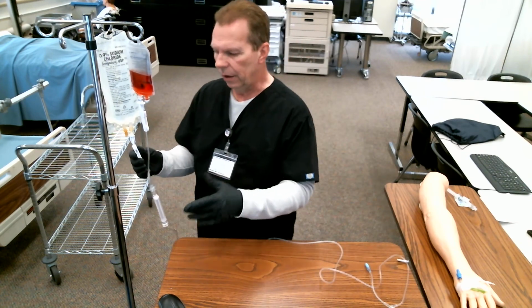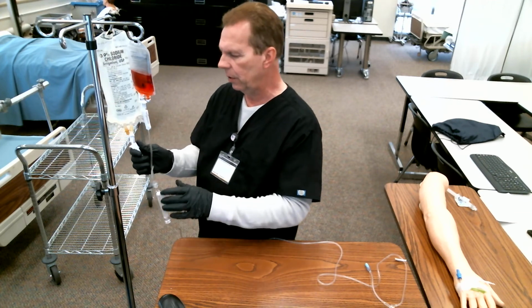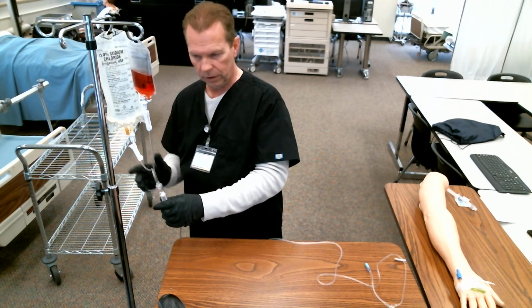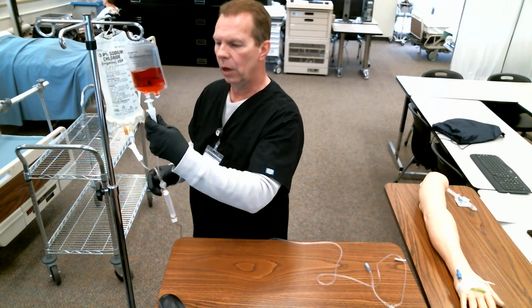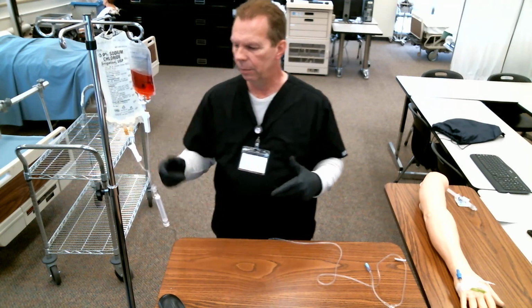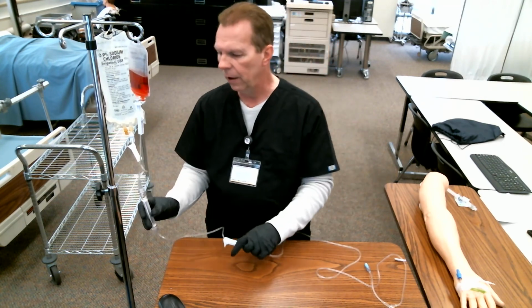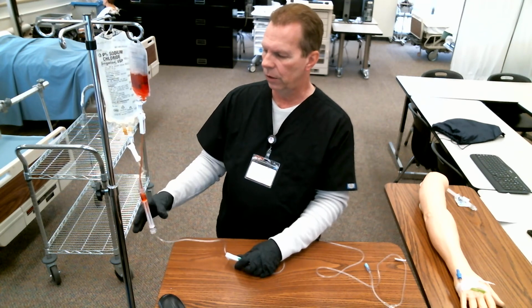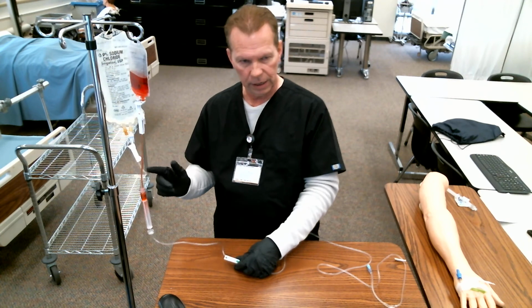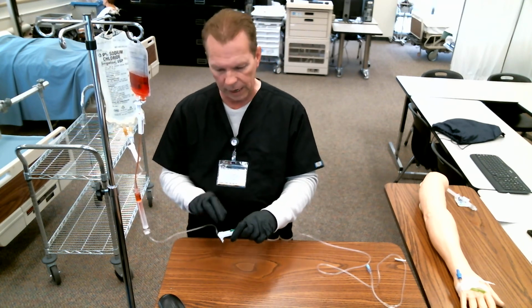So what I want to do now is I'm getting ready to hook it up and everything. I'm going to put it in the pump and all that kind of stuff. So I'm going to close my saline off. All right, so I've got both of them closed again. Now I'm going to open up my blood. Okay, so I open up the blood, nothing's running because my primary regulator is still closed off. And so what I'm going to do is just give a quick squeeze and pull the blood down there. So now I've got blood, you can see in here, and it's at the top of my drip chamber, and I've got plenty of solution over top of that.